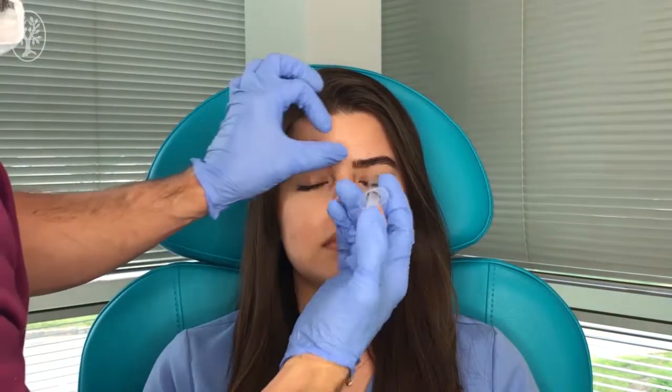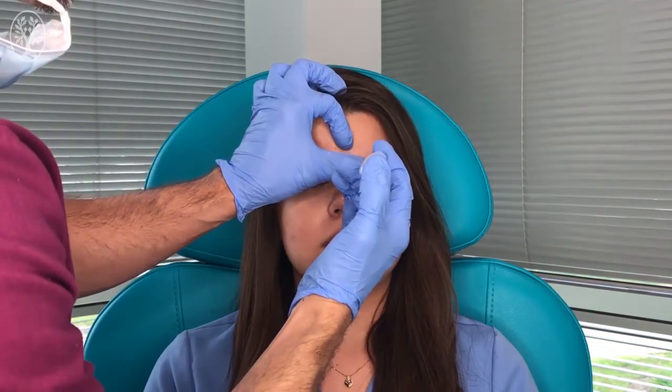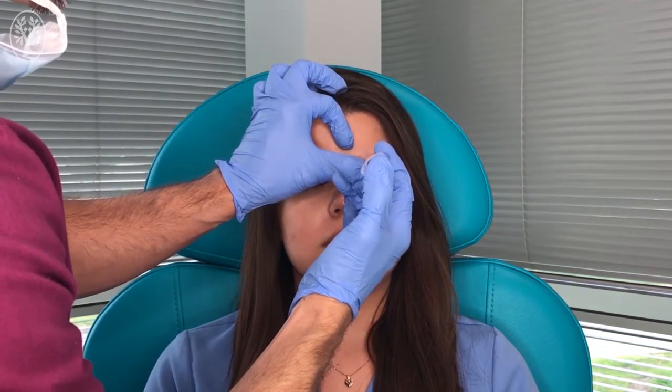Then we are going to use our local anesthetic — lidocaine with epinephrine, 1%. I'm going to start with a 30 gauge needle. We're going to look at the area and do a small injection in the skin, a butterfly technique.